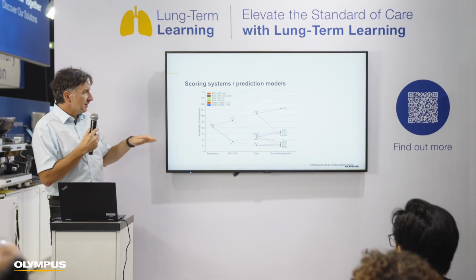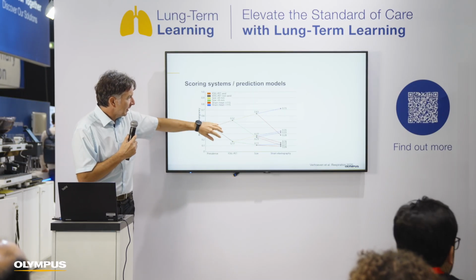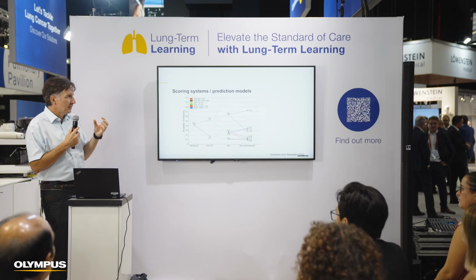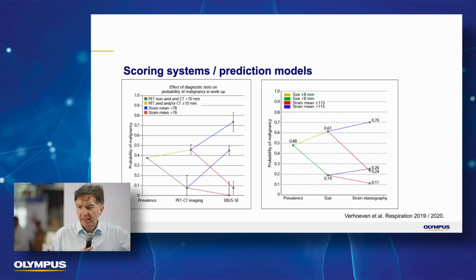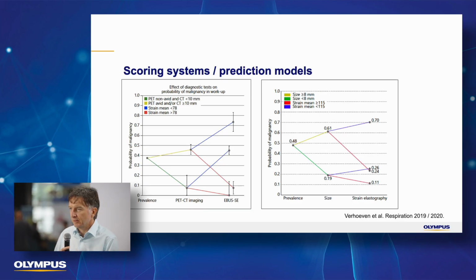And again, basically the same story, when they divided PET and size of the lymph node, that means measured on CT, and again, elastography. And at the end, as you see, elastography changes a little bit the odds ratio, what we really have. So this is important in the cases when we have inconclusive cytology after the puncture, where to keep our suspicion high and where we can be confident that our result, negative cytology, lymphocytes and so on, is really the true result of this.